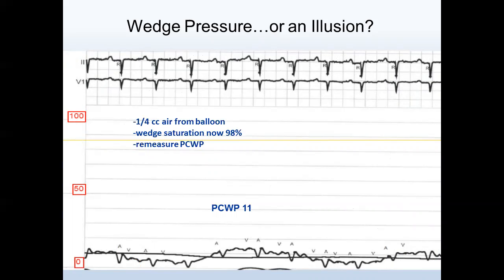Once you have a slack, and now you deflate the balloon, it will just stop deep in. Once you are deep in, you have to be extremely careful. That's why you just don't go inflate your balloon. Boom. Then you're going to rupture the capillary. Very slowly, with 1/4 or 1/5, inflate your balloon, and then you will beautifully see the wedge tracing coming down. So the key is, when you push, just keep pushing slowly till you form a slack.